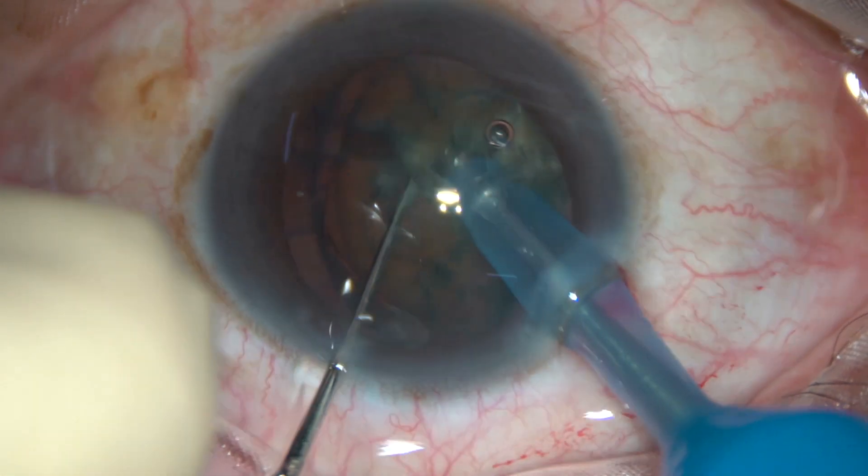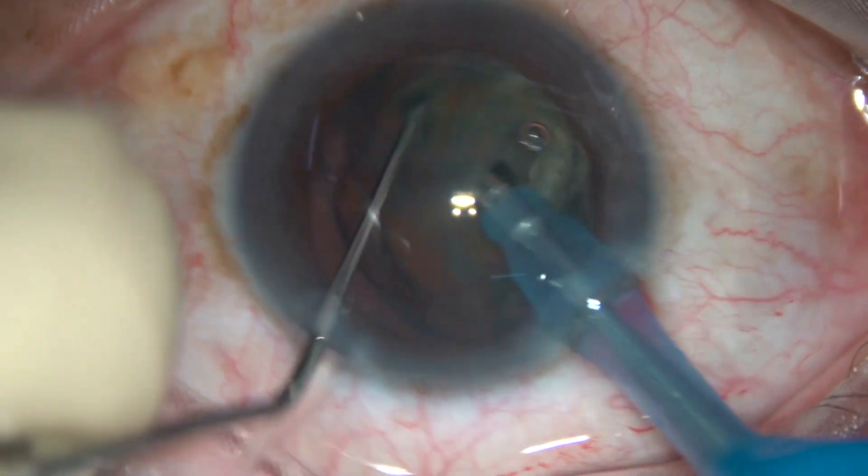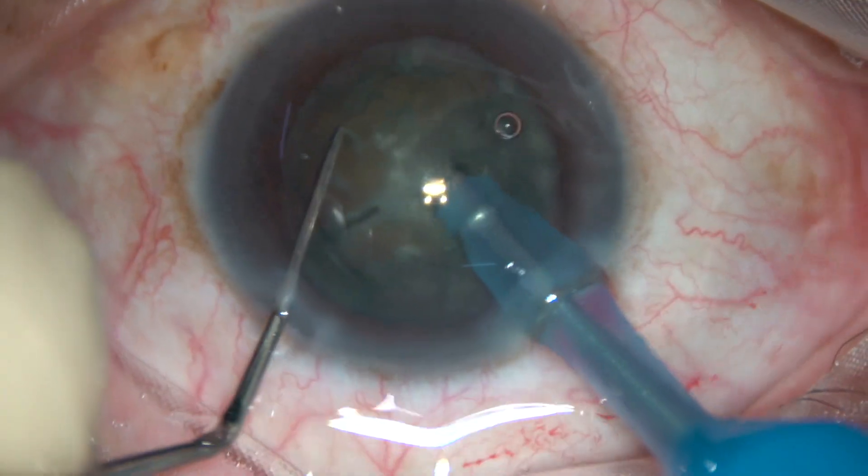So the nucleus divides anteroposteriorly. This is vertical chop.